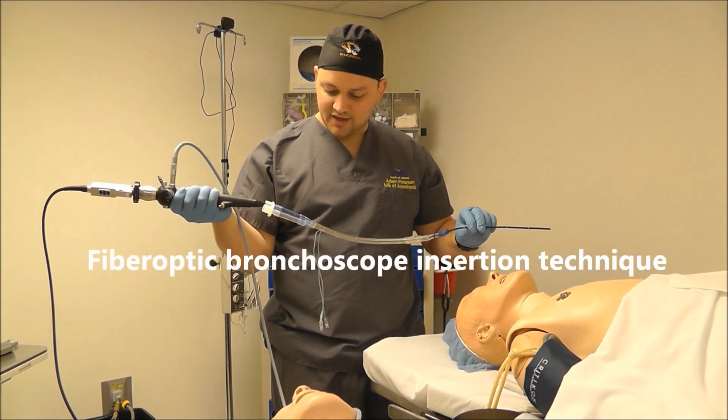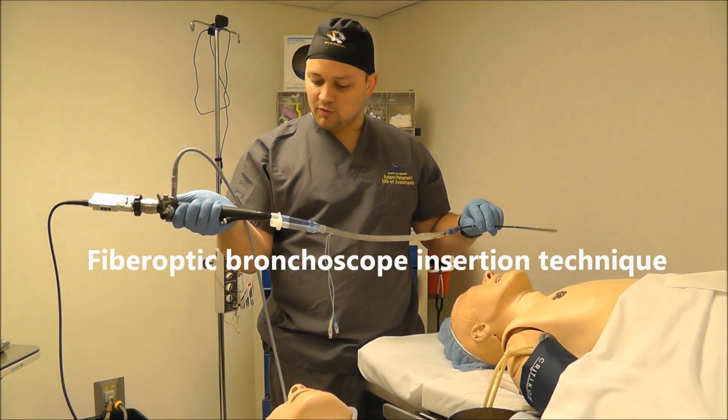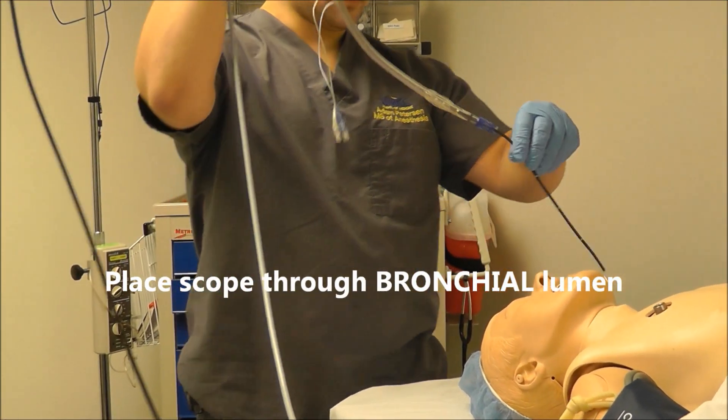The other method of placing a double lumen tube is by using a fiber-optic bronchoscope. You place the fiber-optic scope through the bronchial lumen. Once at the uvula, advance the scope. Once you see the epiglottis, flex your tip upward and advance towards the glottic opening down into the left main stem. At this point, you can advance the tube over the scope into the left bronchus.